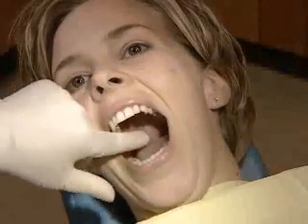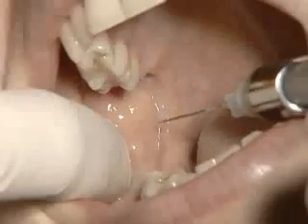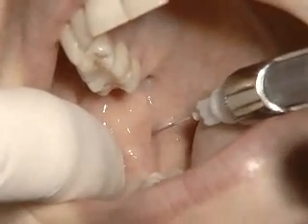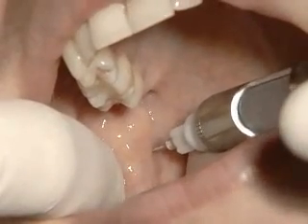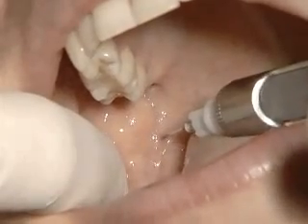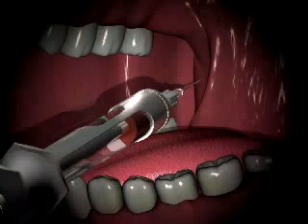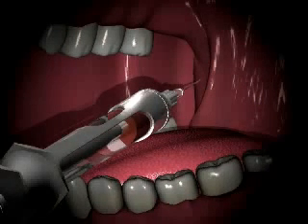After palpating the landmarks, you will insert the needle into the pterygo-temporal depression. The needle is brought in from the contralateral side, and the insertion point is directly there; advance slowly until you go 25 millimeters. Once bone is hit, you withdraw slightly, aspirate, and slowly begin to inject a full cartridge of local anesthetic — unless you are following with a buccal nerve block, in which case you should inject three-quarters of the cartridge.